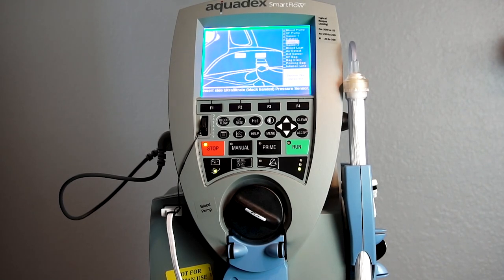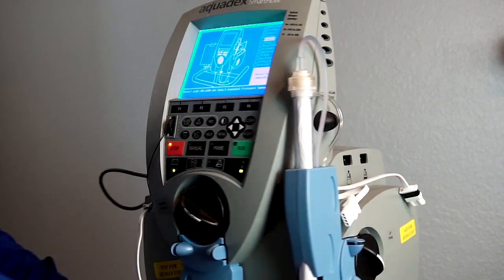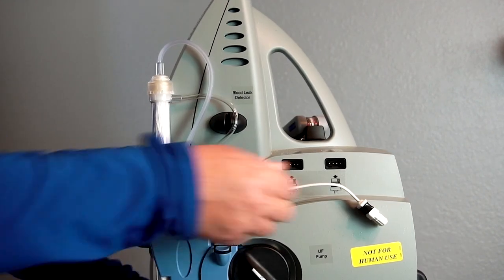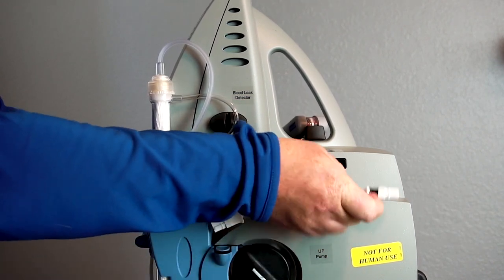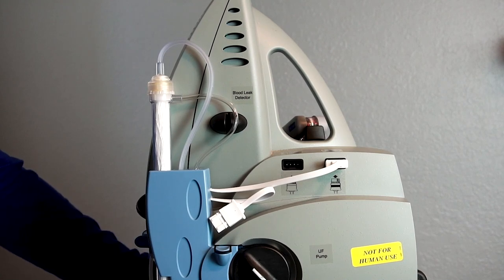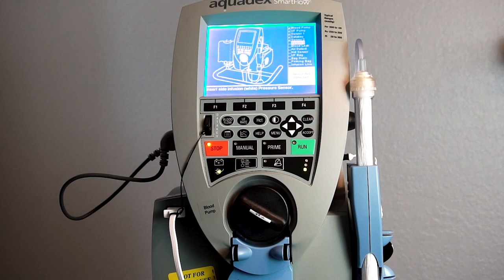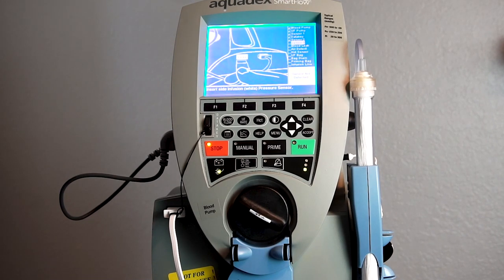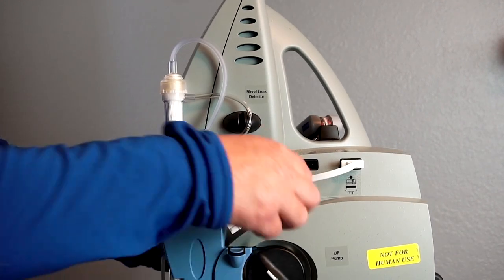Rotate the pump to the side again. Next, you'll insert the UF pressure sensor, or the ultrafiltrate pressure sensor, which has a black banded sticker. Then attach the infusion pressure sensor which is next to the UF pressure sensor. Insert it fully.